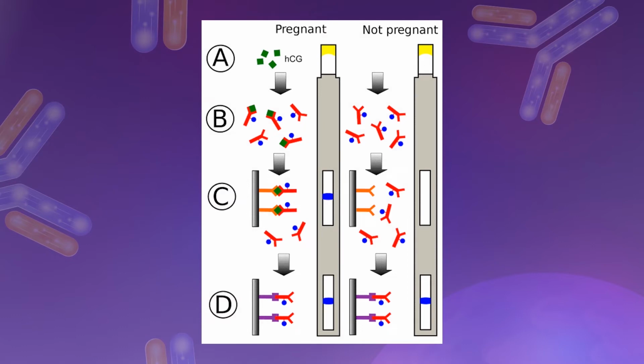So the second antibody is a normal monoclonal anti-hCG antibody. Then, the last step is that the already placed monoclonal antibodies compatible to the anti-hCG antibodies bind to the anti-hCG and trigger a second color change. This is the control test that will cause a color change regardless of the presence of the hormone.